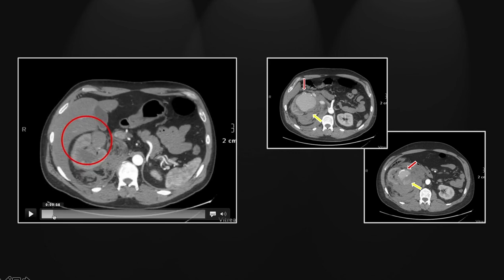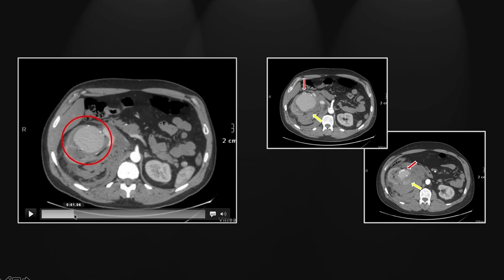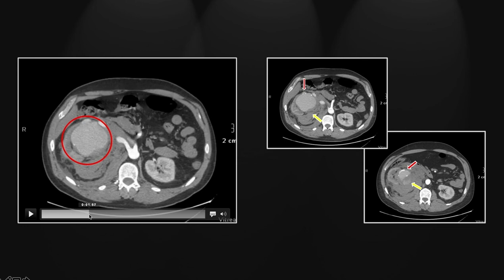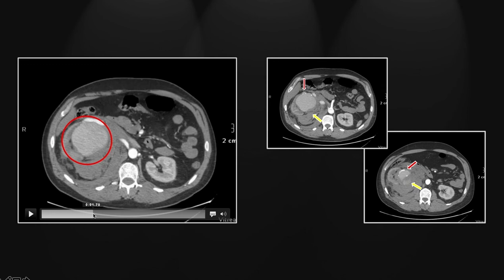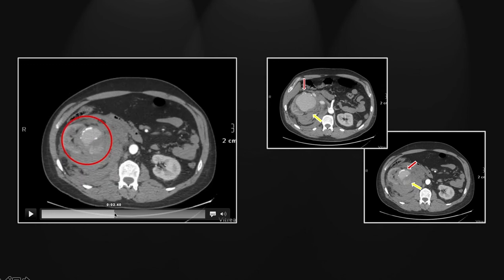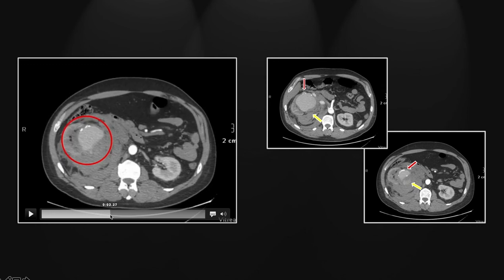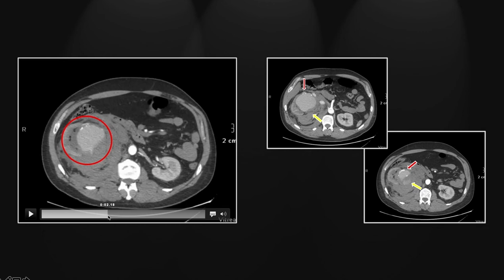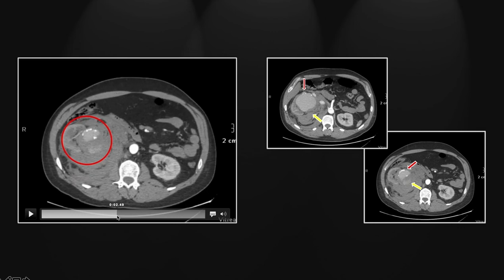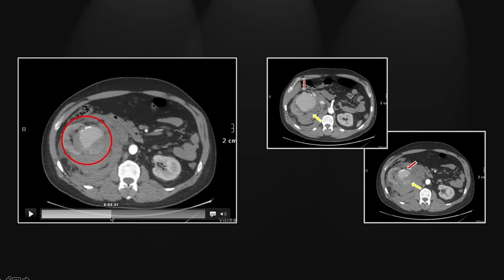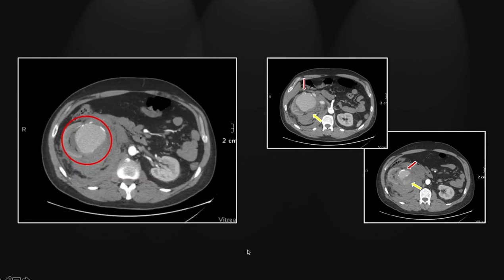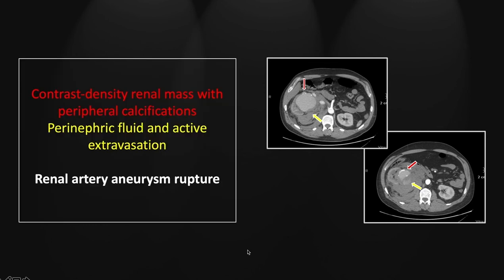Let's look first at that vascular mass — again, homogeneous enhancement, peripheral calcifications, and continuity anteriorly with the enlarged and tortuous right renal artery. Now here, more inferiorly, right on the posterior aspect of that homogeneous mass, you can see that small wisp of extravasation representing active hemorrhage. So that is a renal artery aneurysm with acute rupture and extravasation.